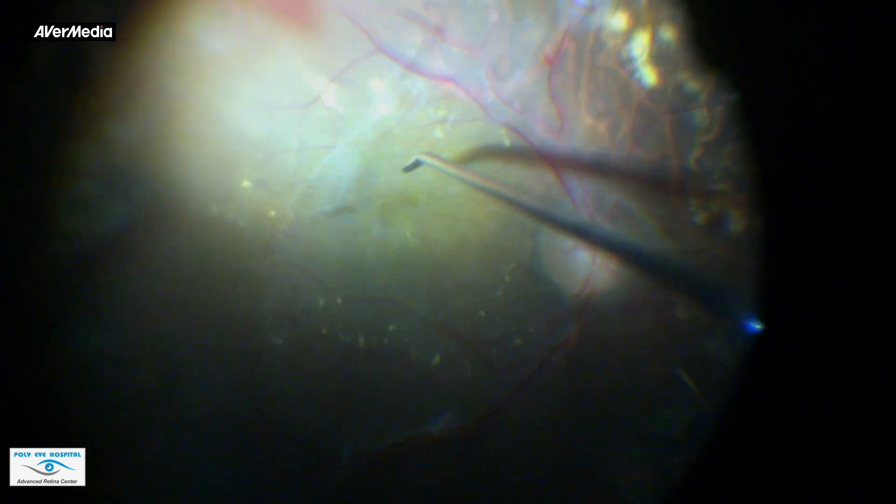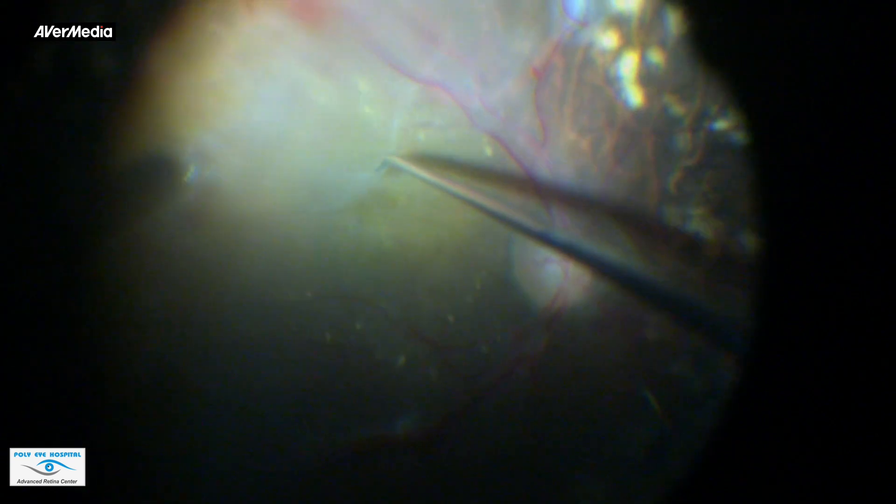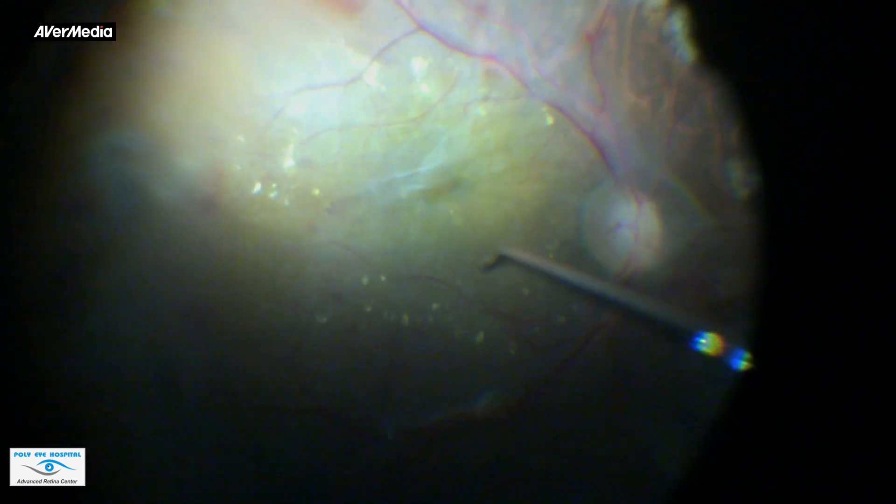Identification of the second membrane is also important as it is the correct plane of dissection, which leads to an easy removal of membranes without any retinal injury.